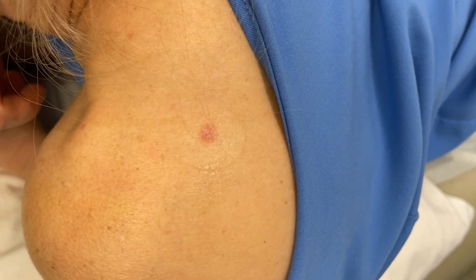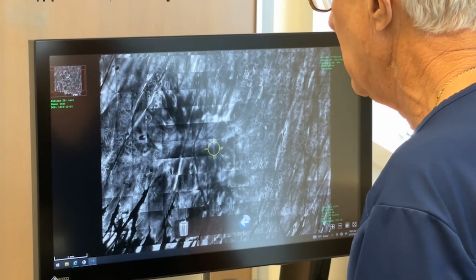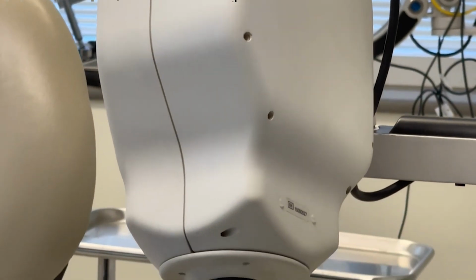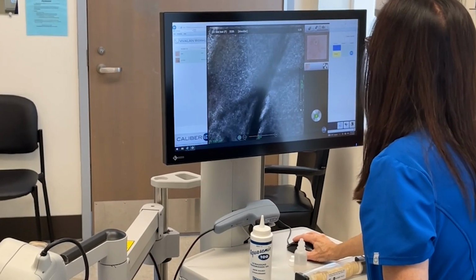And at the same time, he said that they got a new piece of equipment that can actually look deep into the skin and get a better picture of what's there. It's called a confocal microscope. It's actually a laser beam which, when it hits the skin, gets reflected back into a computer screen where you see the layers of the skin live. It's almost like virtual pathology. Now we go from 80% to 90 to 95%.